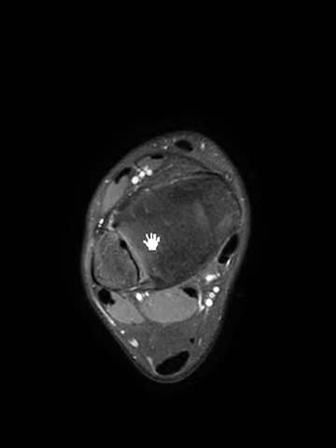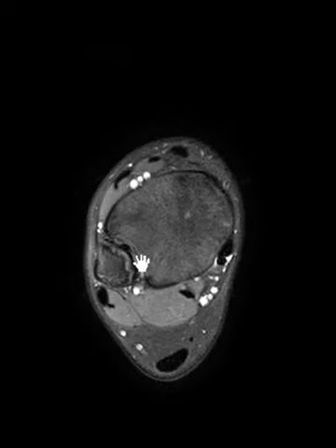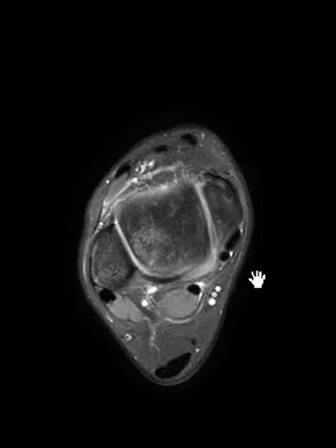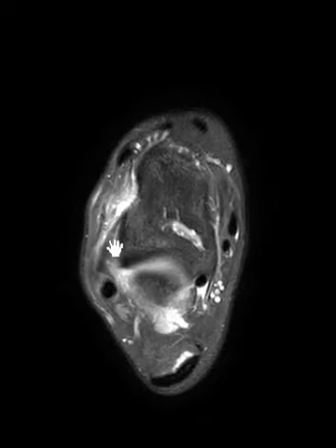Going up higher to evaluate for a high ankle sprain — things look good up here, no widening. The interosseous membrane between the tibia and fibula is intact. The anterior and posterior tibiofibular ligaments are also intact.